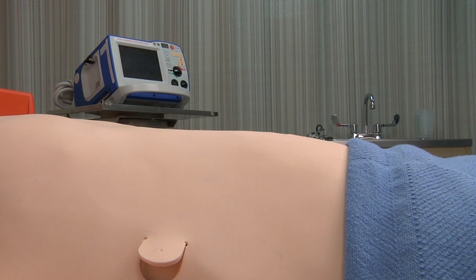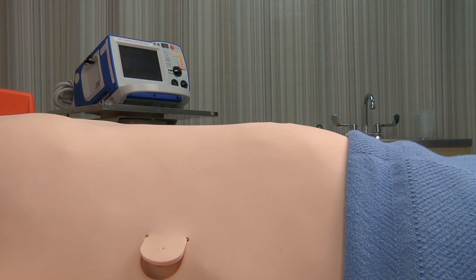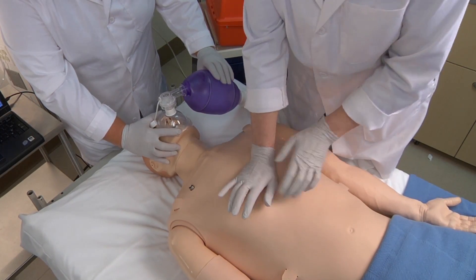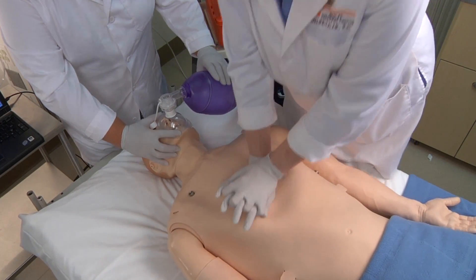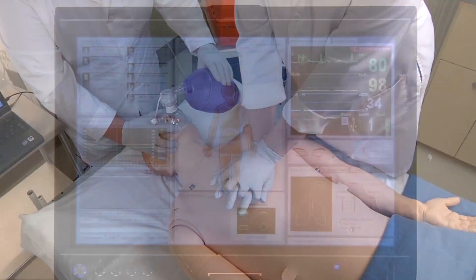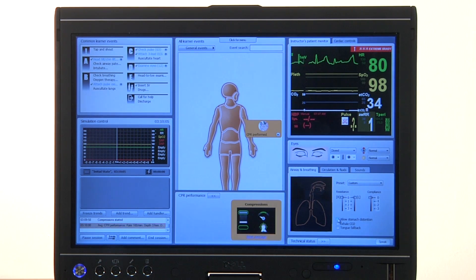The stomach can be distended from mask ventilation or esophageal intubation. Another benefit of simulation training is practicing CPR correctly. SimMan 3G provides the instructor with real-time feedback on the quality of CPR execution in terms of effectiveness of ventilations and compressions during simulation.